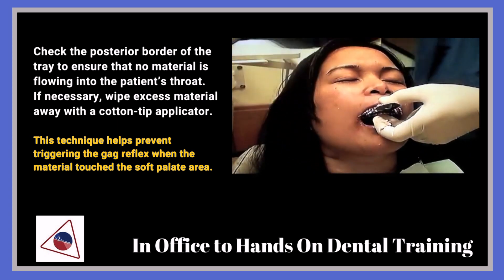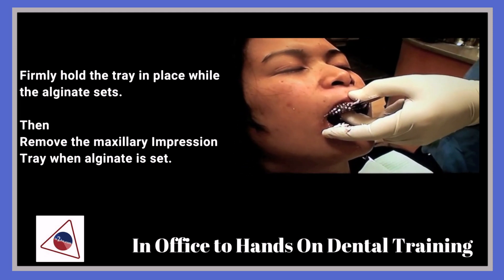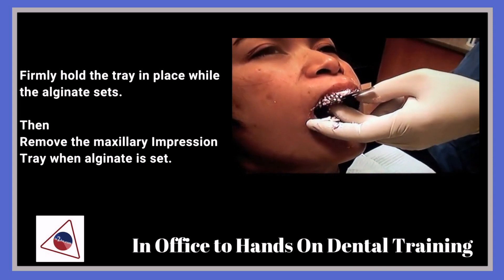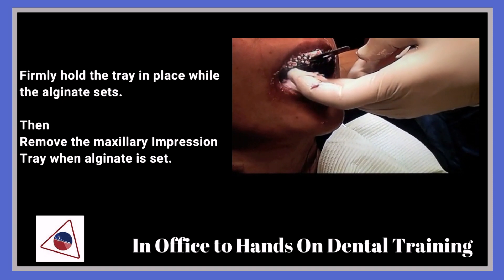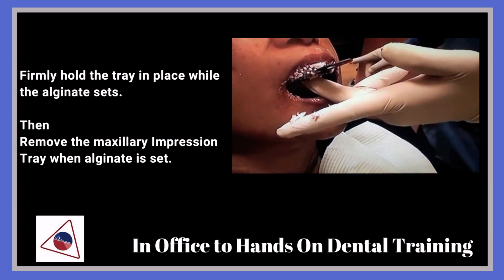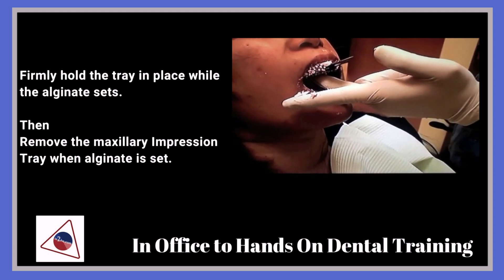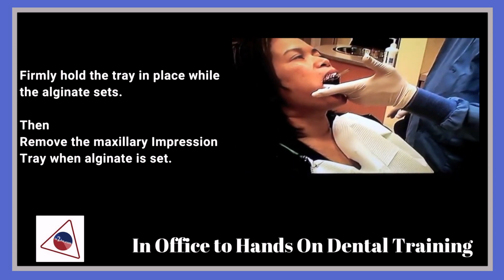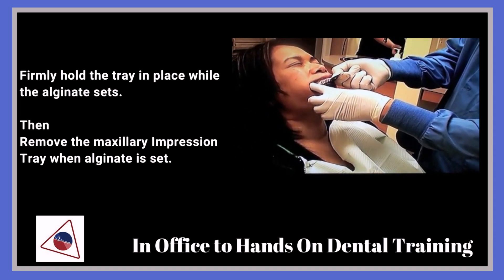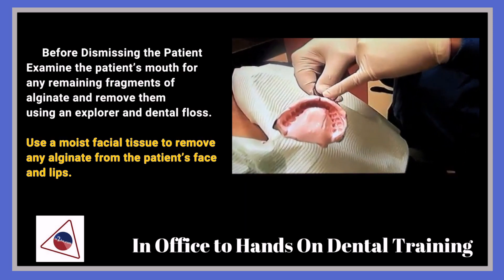This should take about a minute and a half to set. What you're doing is feeling to see if the tray material is starting to set. Once it's set, you can go ahead and take the tray out — start from the back and disengage the tray, making sure you've got the front up and all the teeth captured.